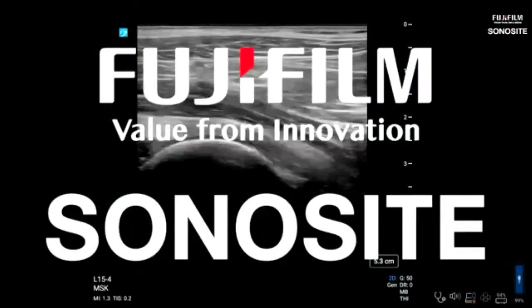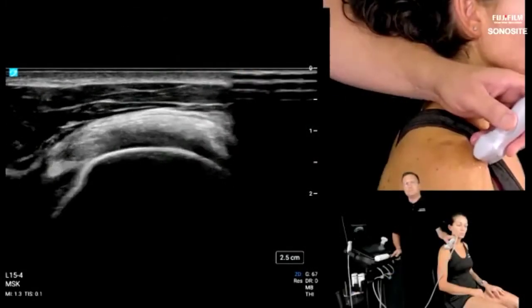And we do have a question. Are impingement signs helpful while doing scans?